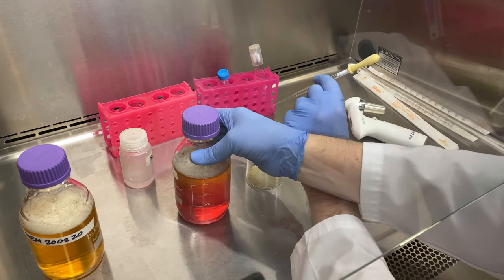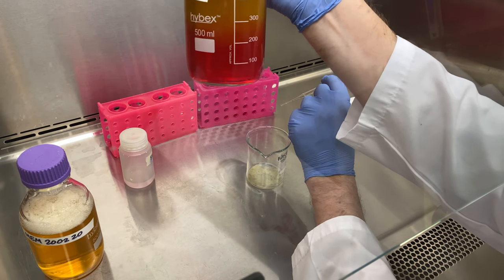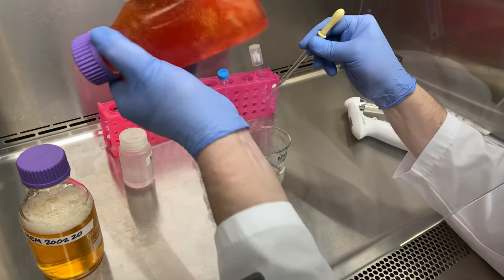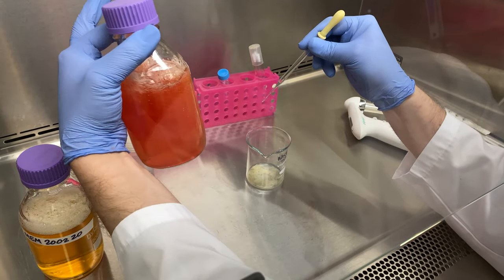Notice it's quite beautiful — it's red on the bottom, orange in the middle, and yellow on the top. However, we need to thoroughly mix it. I'll tighten the cap and do an inversion. Notice the solution is now orange.